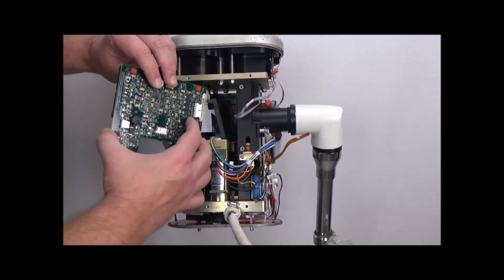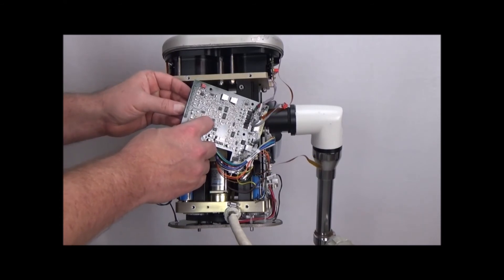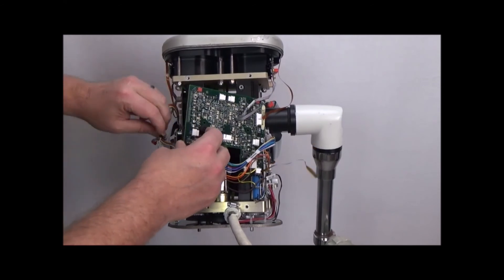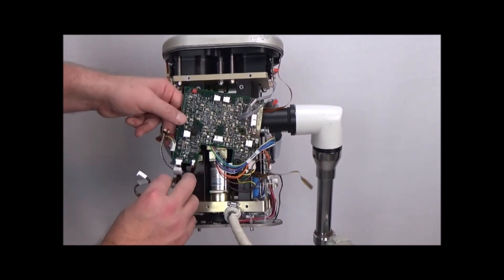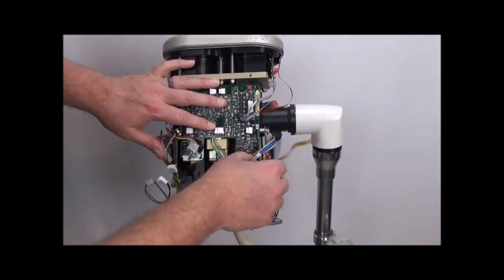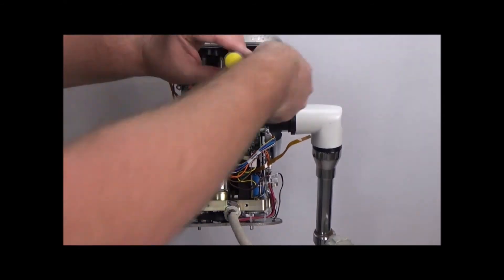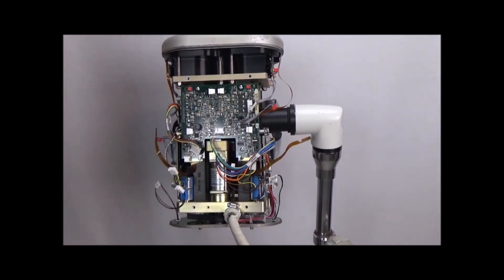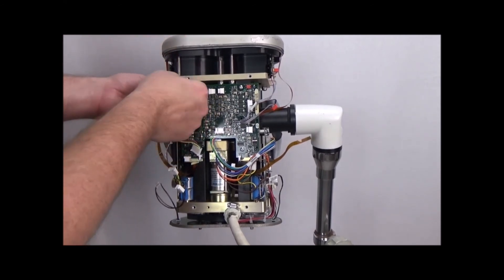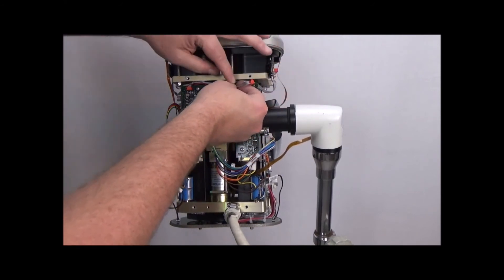Then reattach the interface board. Start with the cable that was in the back. Make sure all of our wires are out of the way, and we'll start by putting the screws back in. Then we start reconnecting our connectors, starting with the syringe sensor cables. Tuck this back in here as best as possible, and same thing over here — tuck it back as best as possible.